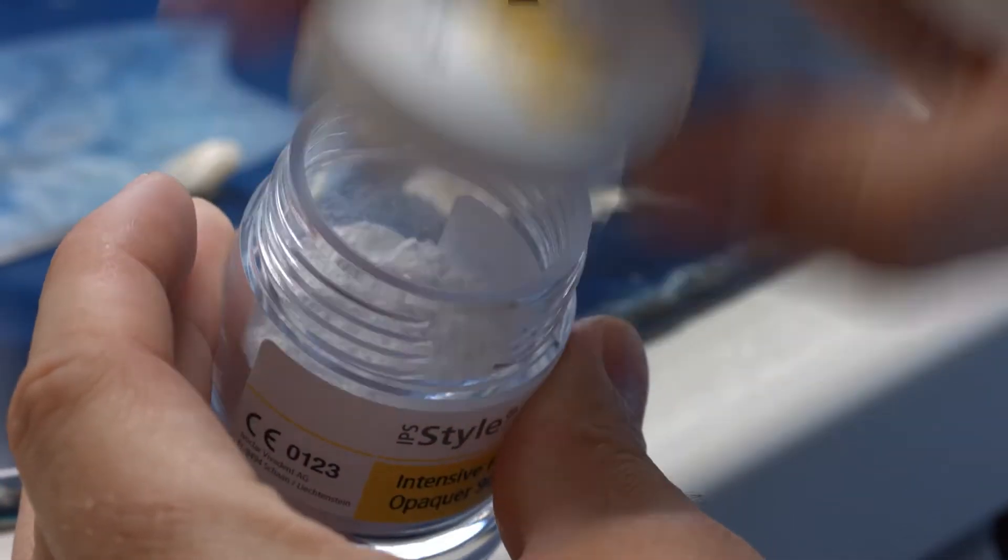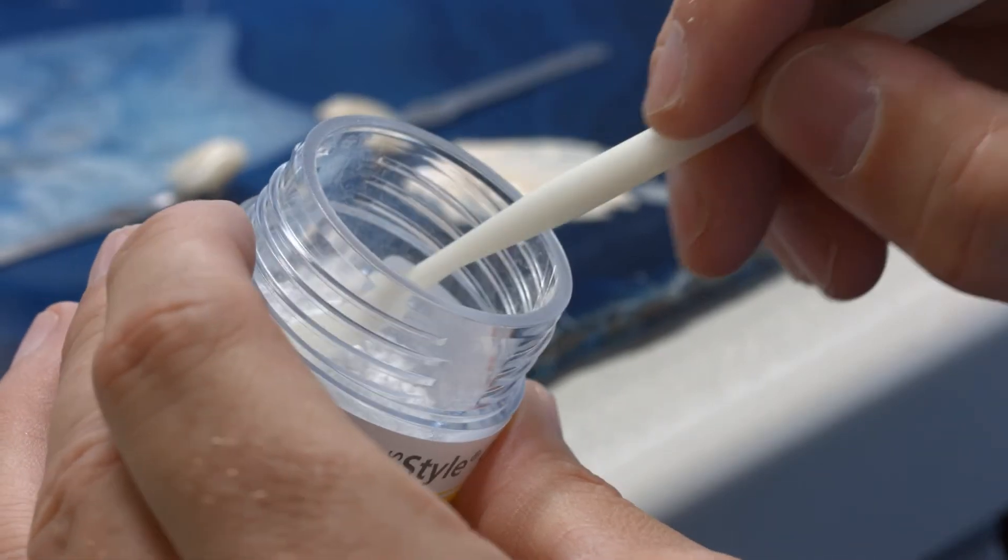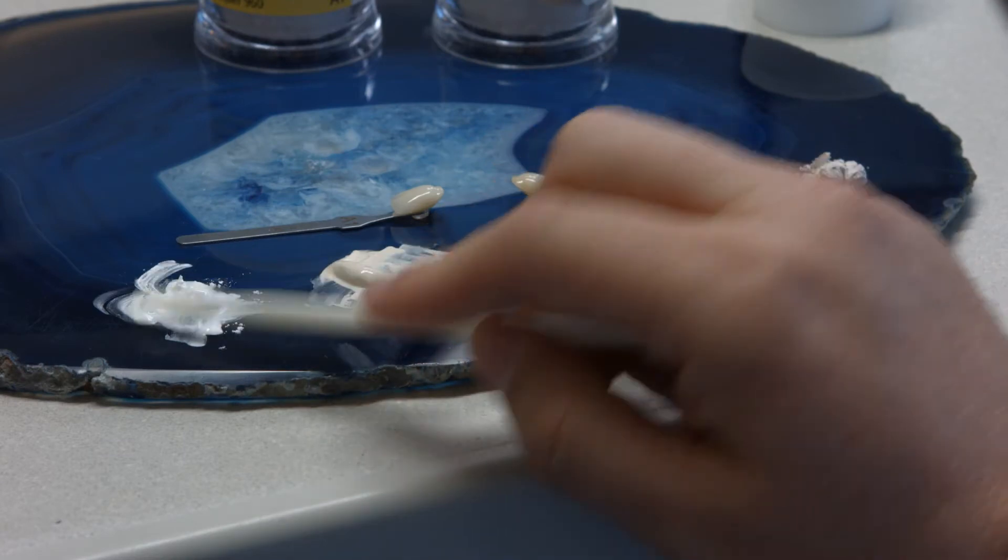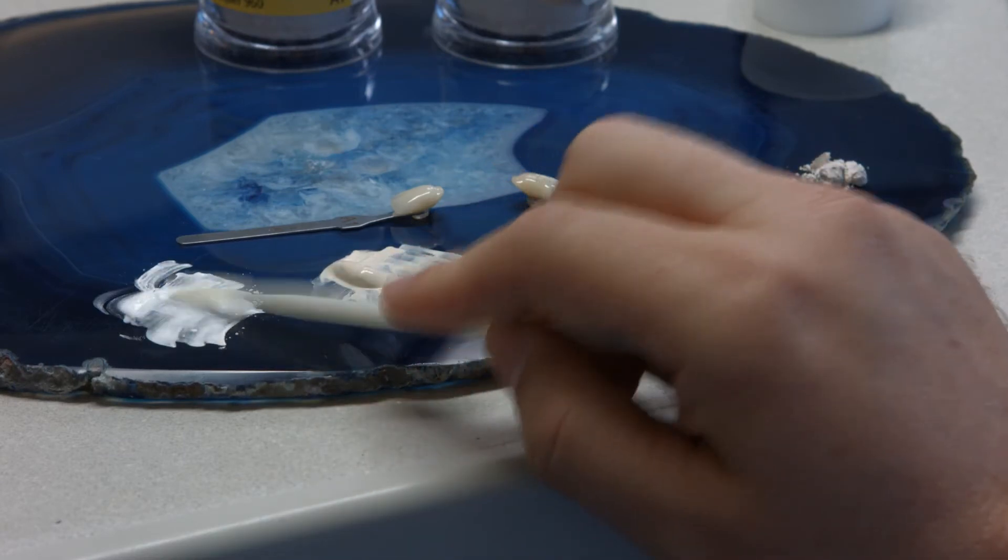For the characterisation of the restoration, additionally use IPS-style Ceram Intensive Powder Opaquer and also mix it with some opaquer powder liquid until you obtain the desired consistency.